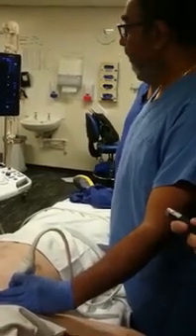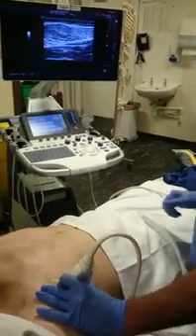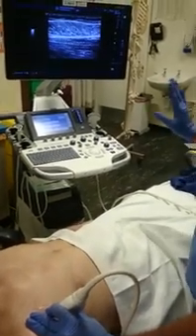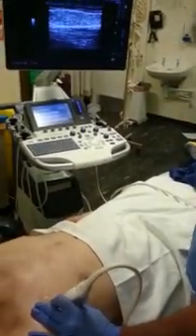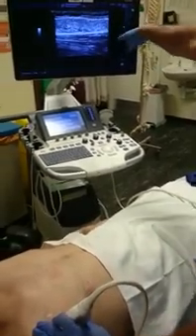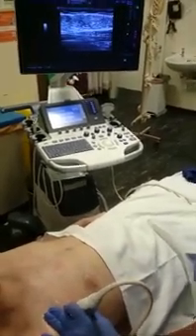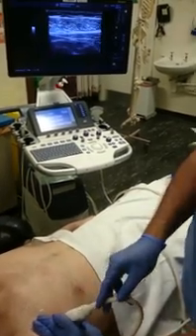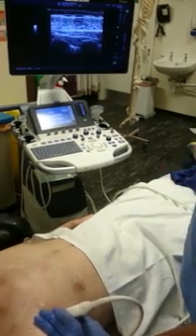So that is the first step — first you have to identify and then try to lose that one by coming downwards and laterally to find two muscles. Just see the two muscles, don't see the ribs now. The top muscle is the pectoralis major and the lower one is pectoralis minor, and you can probably see the arteries coming here. You can appreciate the whole pec 1, pec 2 block.